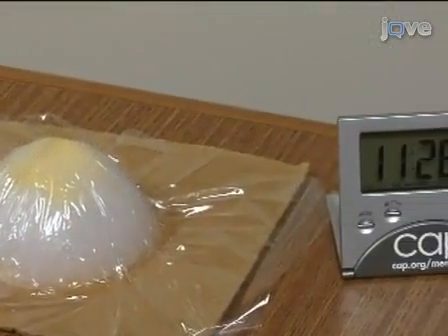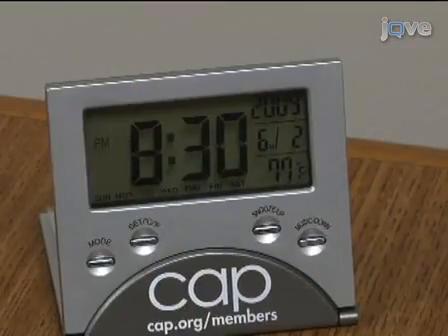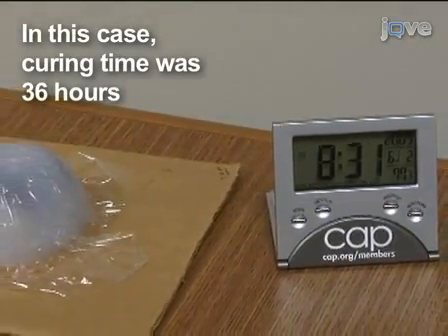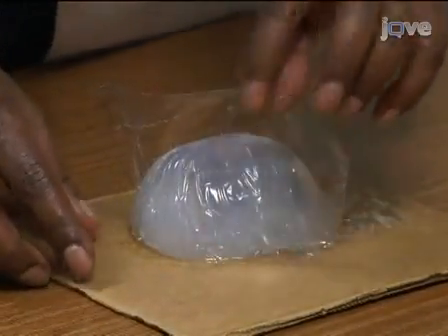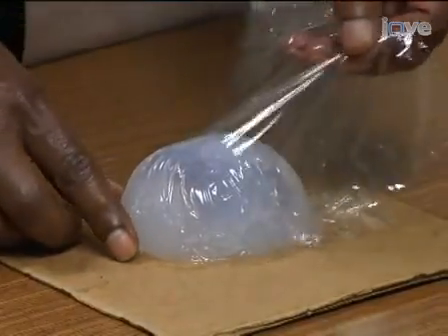The caulk sets when exposed to air. You can leave the mound at room temperature above 60 degrees Fahrenheit or incubate at 37 degrees Celsius to hasten the curing. After curing, the caulk is firm, and you can easily peel off the plastic wrap. The FNA phantom lesion is now ready to use for practicing the FNA procedure.